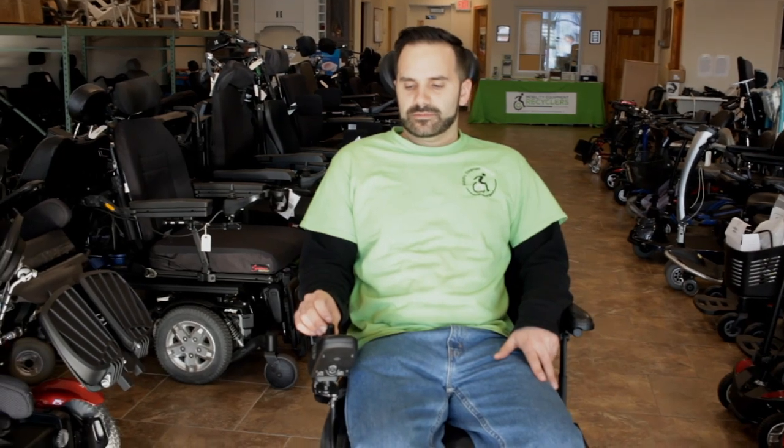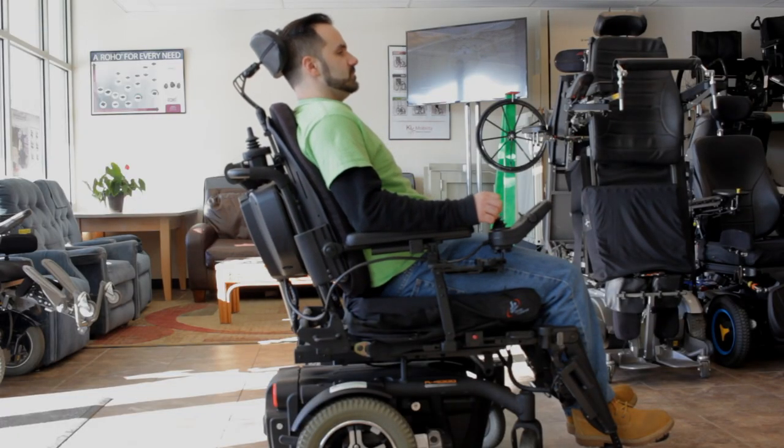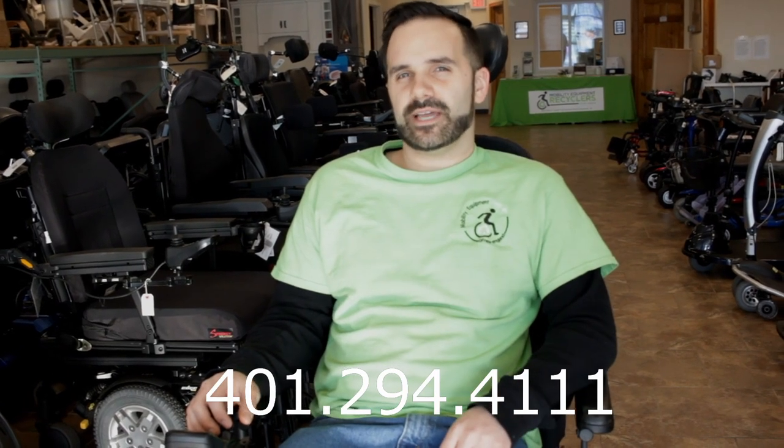So in addition to tilt, I'm just going to recline the back. Maybe I want to fall asleep for a little bit, kind of catch a snooze. This chair has a lot to offer. If you have any questions, or if there's anything that I did not cover today, you can give us a call at 294-4111. We appreciate you taking the time to watch this video.